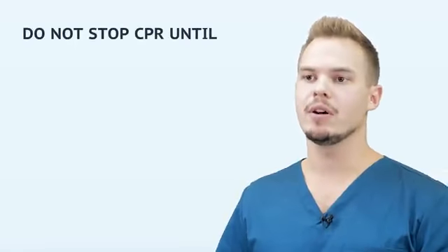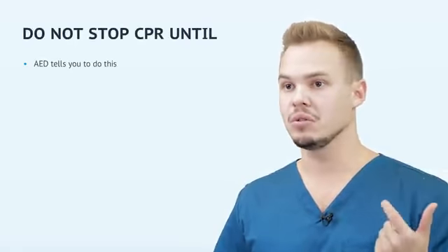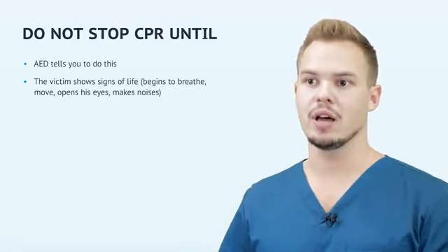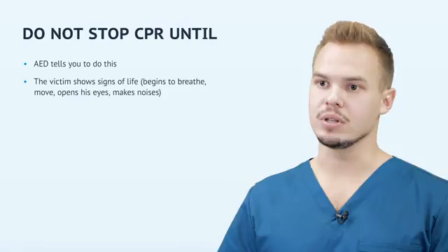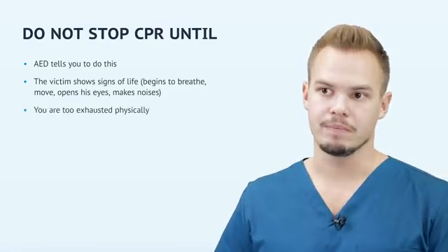Do not stop CPR until your AED tells you to do this, the victim shows signs of life, begins to breathe, move, opens his eyes, makes noises, or you are too exhausted physically.